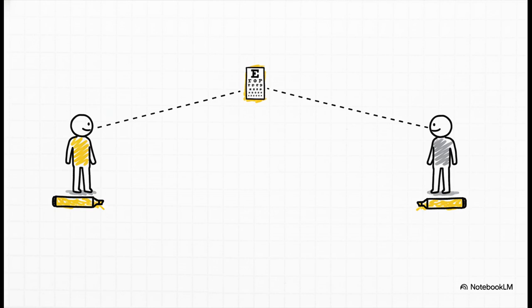And this is exactly how you'll explain it to your patients, in simple terms. If they have 20/40 vision, you tell them, look, to see that line of letters, you have to be standing here at 20 feet. A person with standard vision could back up all the way to 40 feet and still read that same line just as clearly. It's just a direct comparison of their performance against the standard.